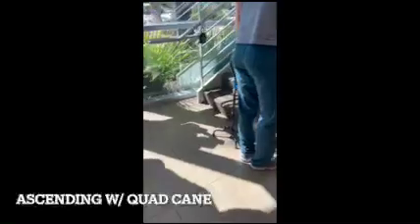Left side. So I would want to turn it this way, so the flat side gets up to the stairs. I do not want the wide side because you kind of lean back this way. So I would be here. So I would actually do strong side, strong, and then together. Strong, together.